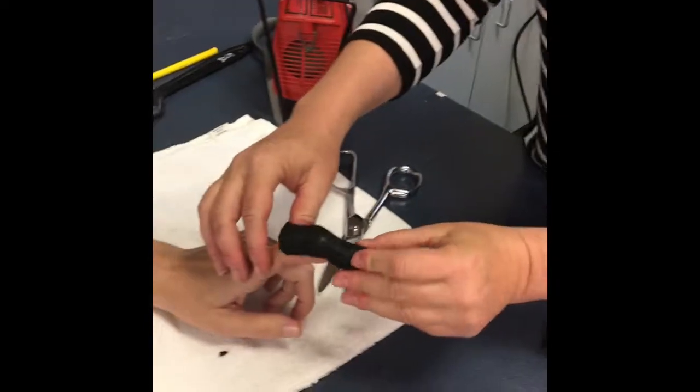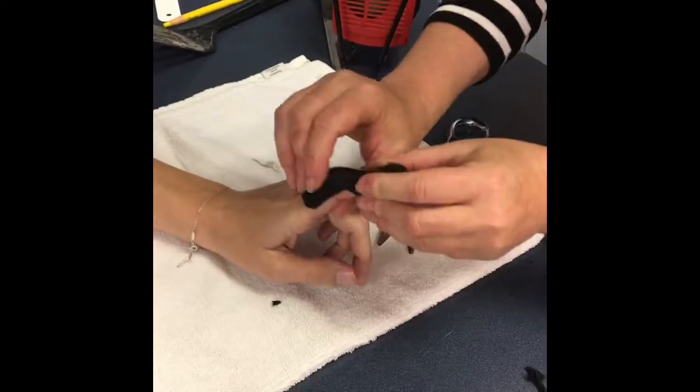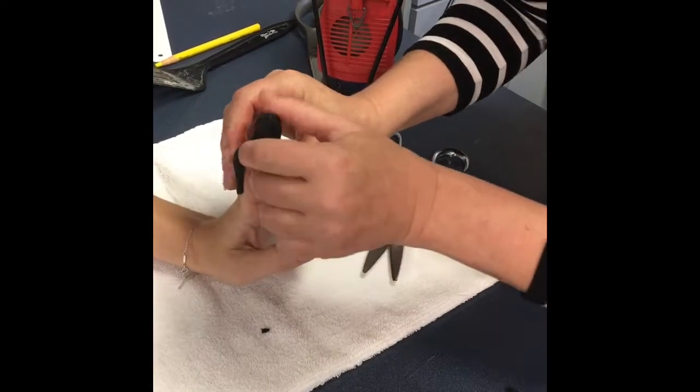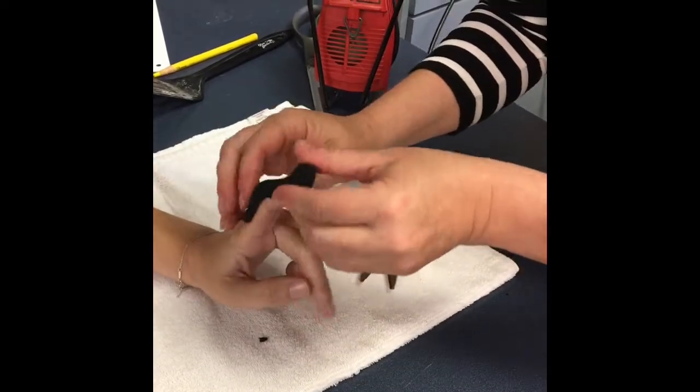Now I'm just going to go ahead and check that fit to ensure that we have good clearance at the PIP to allow flexion during exercise.